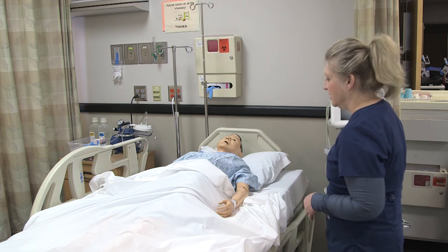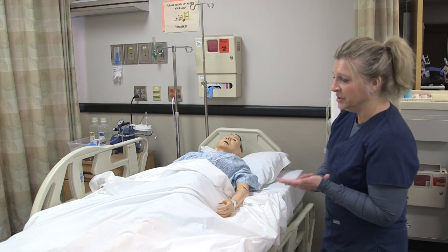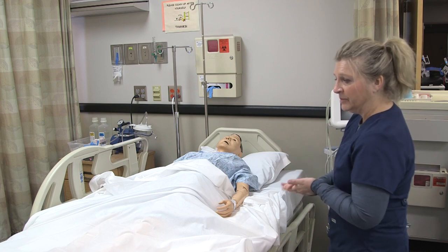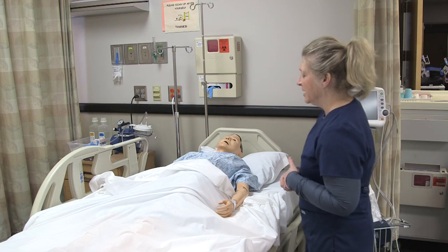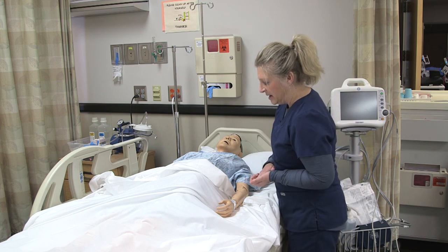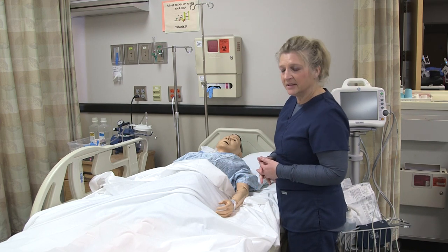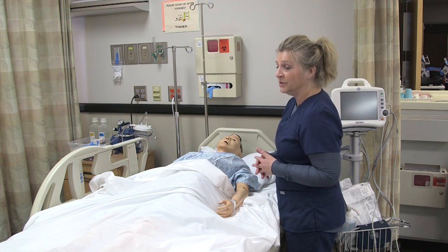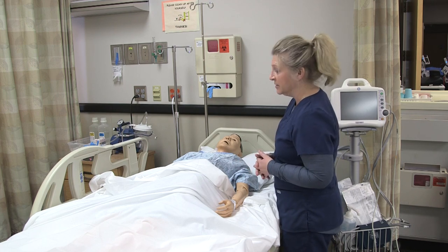You want to make sure that you introduce yourself to the patient, wash your hands, and also make sure you put the bed to a comfortable height, provide for privacy, and explain to the patient what you're going to do. After you verify the patient, identify the patient and verify that it is who you want to put the telemetry monitoring on.